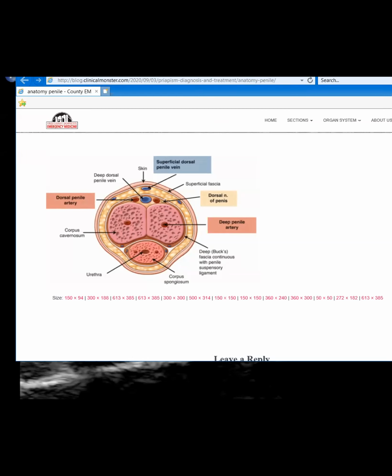And then I have one more quick case. We've not seen this on ultrasound a whole lot. We do a few MRs. We see it. Yeah. Ultrasound is quick and easy in the ED if you know what you're looking at. So this patient subsequently went to the OR and was fixed. All right. So here is my second case.